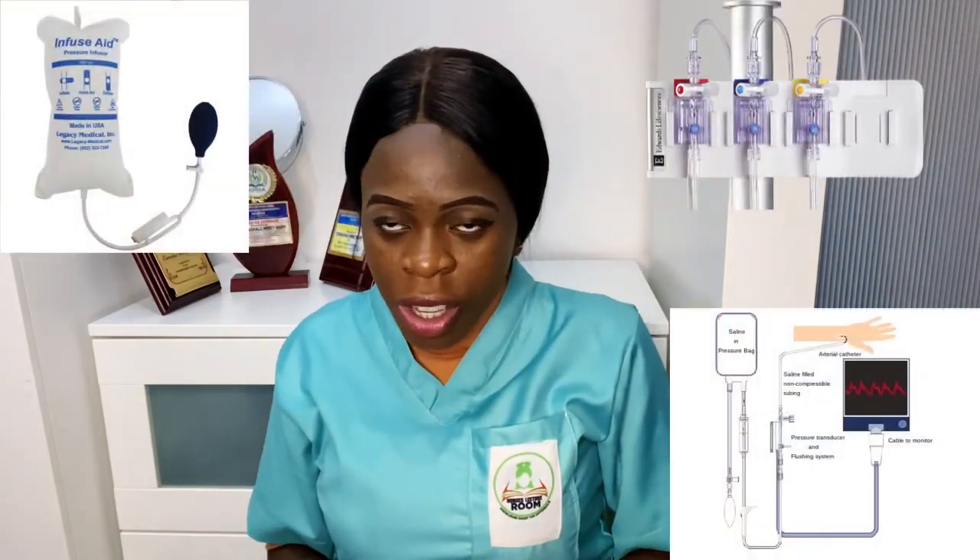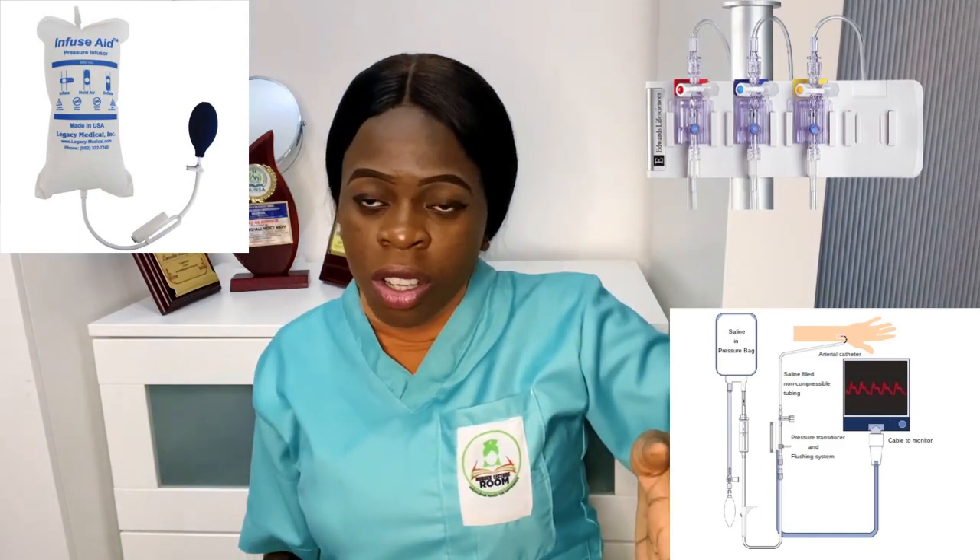There is also the expense of materials and equipment. For the arterial line, you need cannulas, transducers, and a lot of setup equipment. For a blood pressure cuff, you can use it for multiple patients as long as you clean it after each use. But with the arterial line, you cannot reuse the cannula between patients — you must use a fresh one each time, making it considerably more expensive.